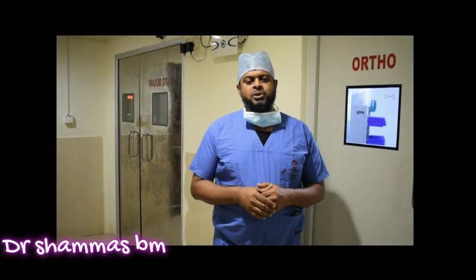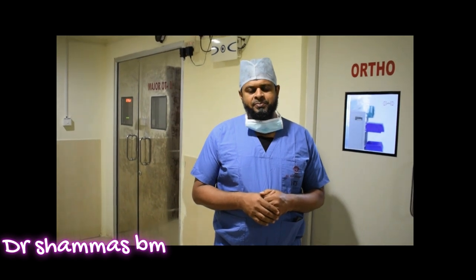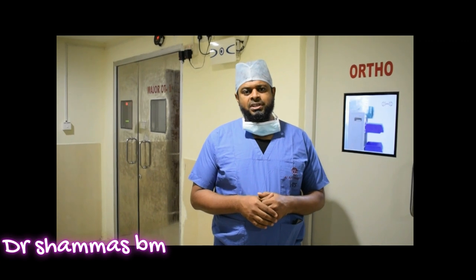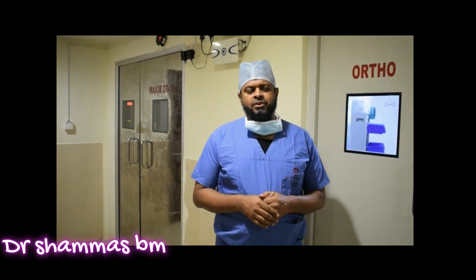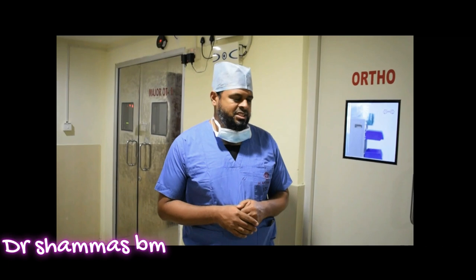Today we have a patient with femoroacetabular impingement — a pincer type of impingement. What we are going to do is an all-arthroscopic osteochondroplasty with a labral repair and a capsular repair. We will go through the different stages of the surgery.